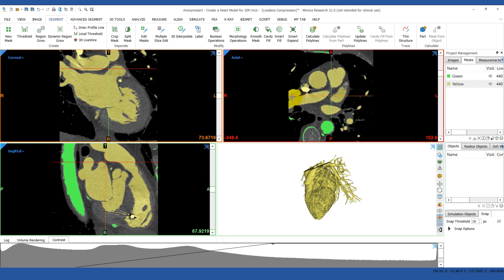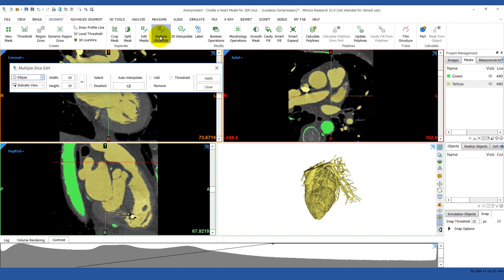Now we have to manually break any unwanted connections in the mask. To do this we're going to use the Multiple Slice Edit tool from the Segment menu. In version 21 you have the option to auto interpolate. By checking this box, the software will automatically interpolate between the slices you mark, so you can skip a couple of slices at a time.